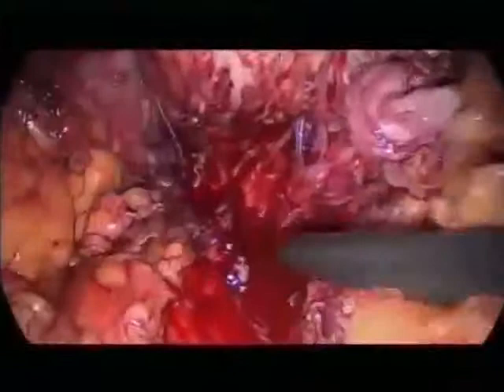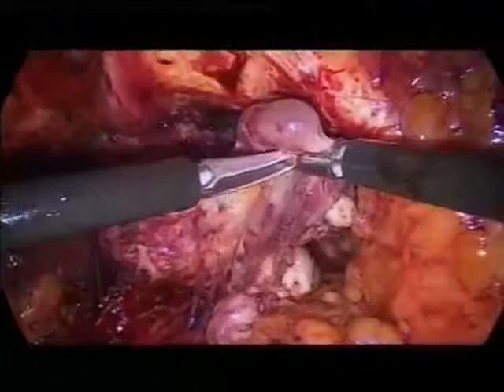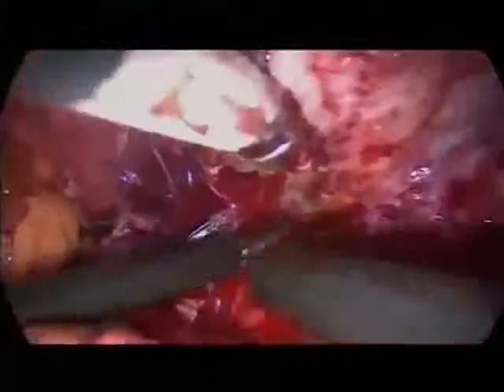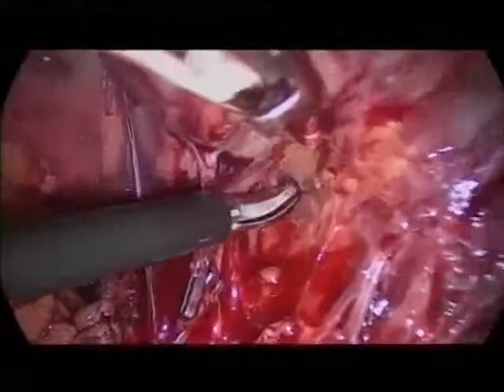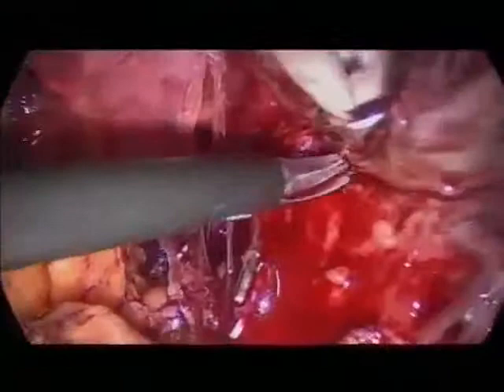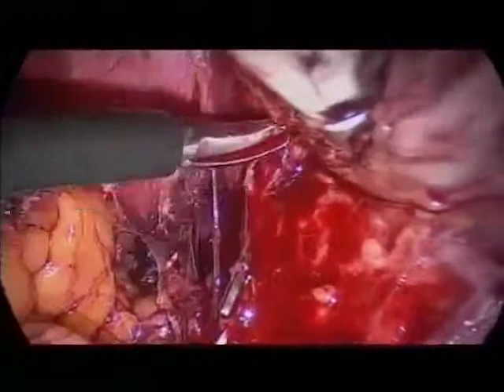And the assistant has grasped the seminal vesicle from the left side. And this makes the access to the posterior part of the prostate easier for me. And whenever I can, you see, we push it down. And we don't use any energy at this part of the procedure. So you are more or less in an avascular plane, only with some minor vessels coming. That's right, only some minor vessels running into the prostate. Especially when you come closer to the apex, there's a nice plane where you can dissect. So we leave this, we go to the other side, and we do the same on the other side.